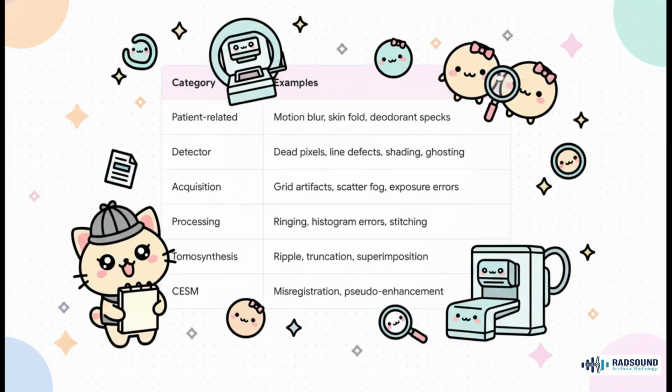Okay, so where do we even begin? Well, to solve any mystery, you've got to organize the clues, right? As you can see here, all these different artifacts can be neatly sorted based on where they came from. Understanding this is our first and, honestly, our most important step in cracking the case.